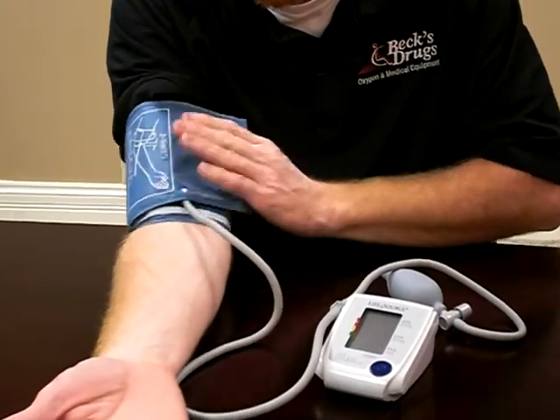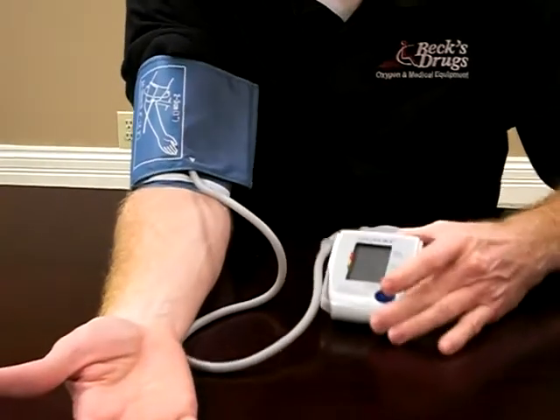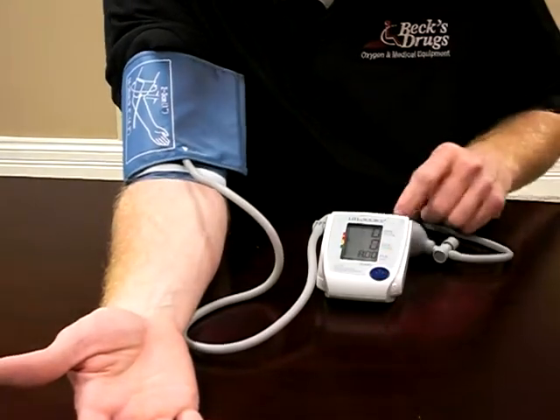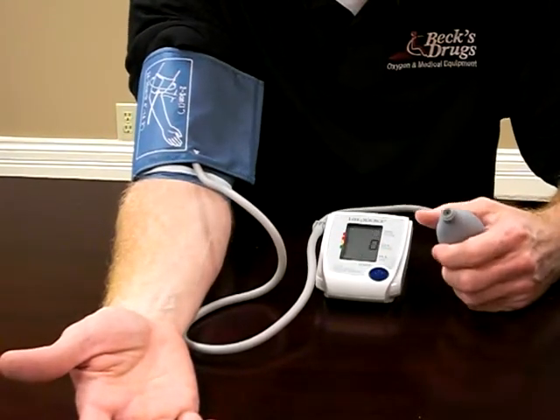You can just leave your arm on the counter like that. Turn your machine on — it should be ready to go.